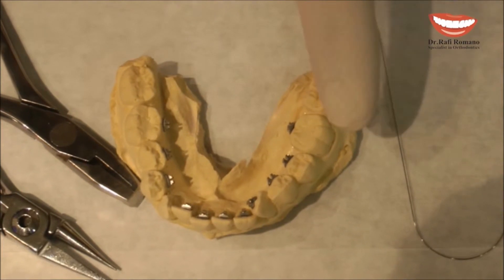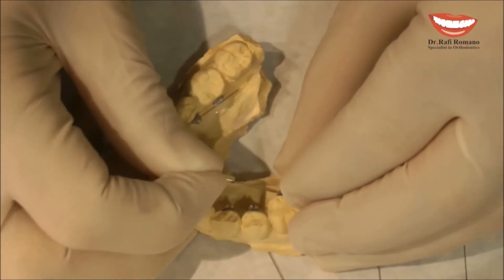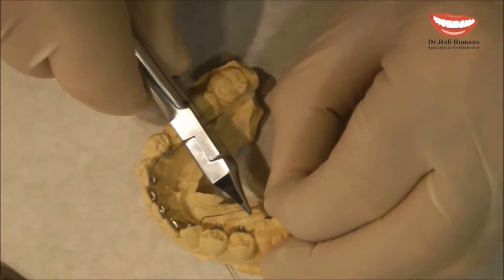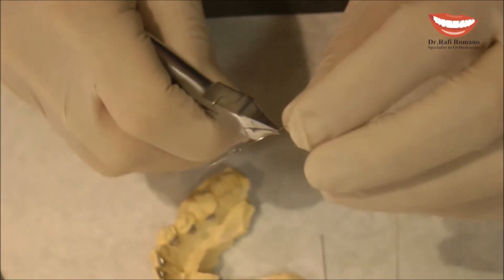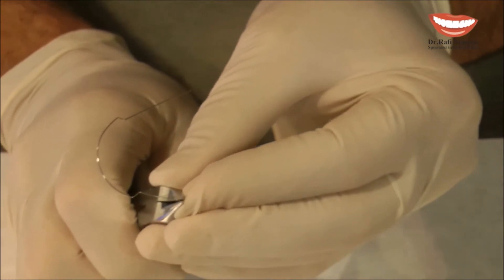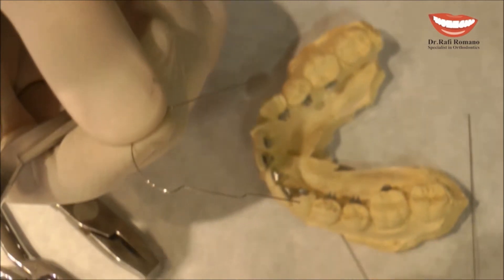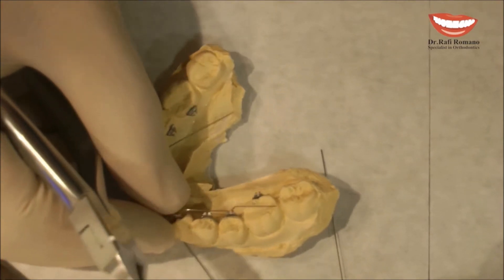I can also add another bend. For example, on the left side you can see that the molar is much wider than the premolar. Remember that we are discussing passive bends, which are designed to fit the wire to the shape of the arch, so I can add one more bend between the premolar and the molar on both sides.